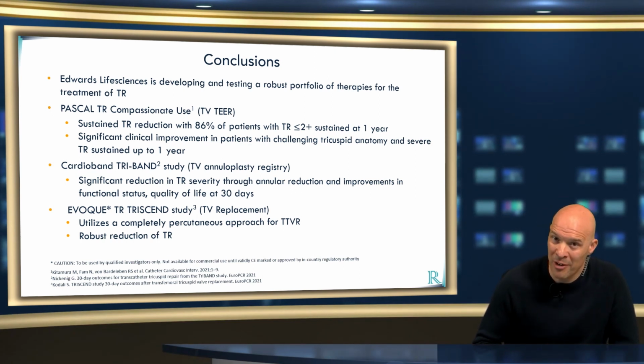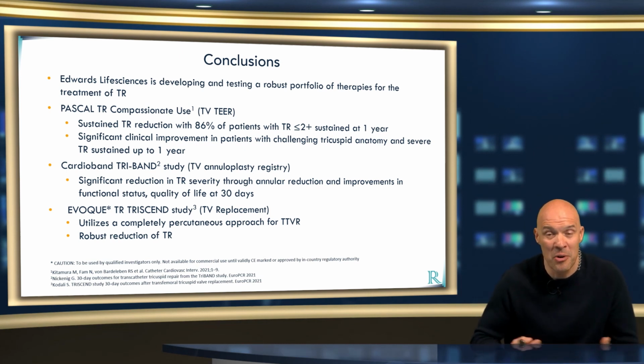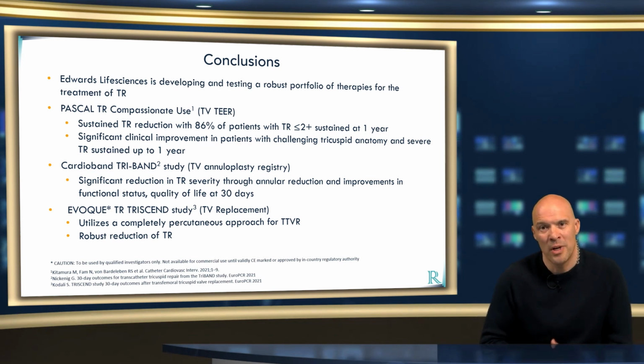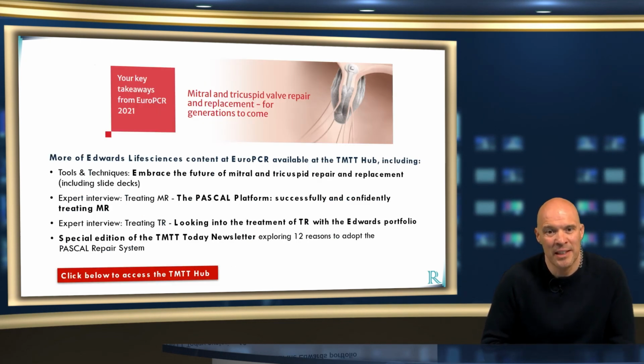I think it was also very interesting to learn that annuloplasty also works in the tricuspid space, and potentially we have been thinking about complementary techniques. Who knows? And I think the final discussion on transcatheter tricuspid valve replacement with the EVOQUE system opens up a new spectrum where we'll not only try to reduce the TR, but even abolish TR. I think with that, I'd like to close this section.